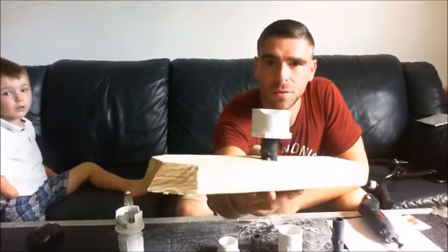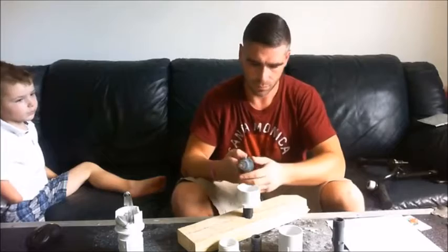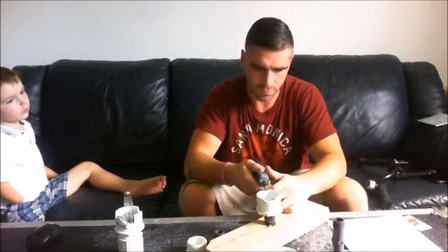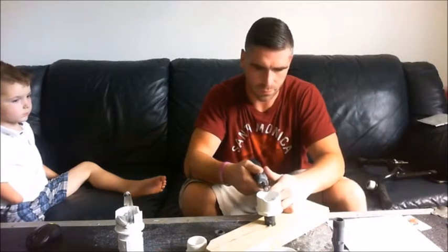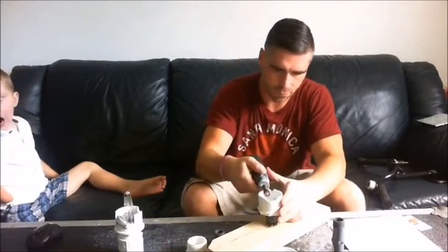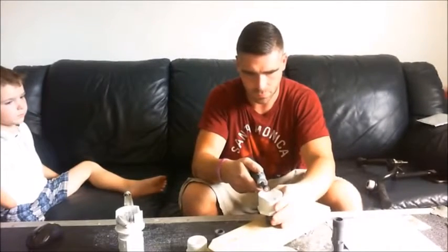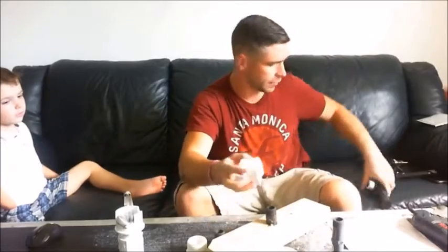All we did here was just cut a little groove in the side, and then we're going to do the same thing for the opposite side. It doesn't have to be perfect — you just want it to be able to sit a little bit nicer on the handlebar.